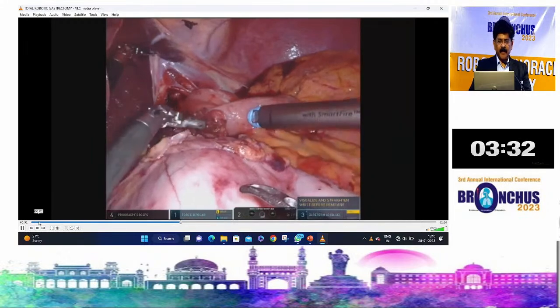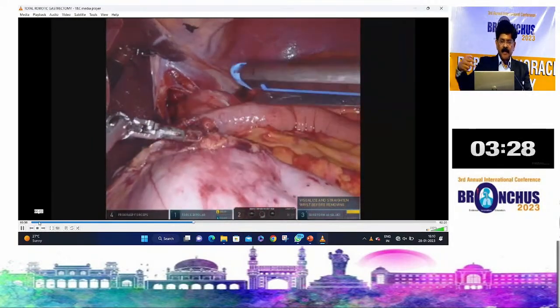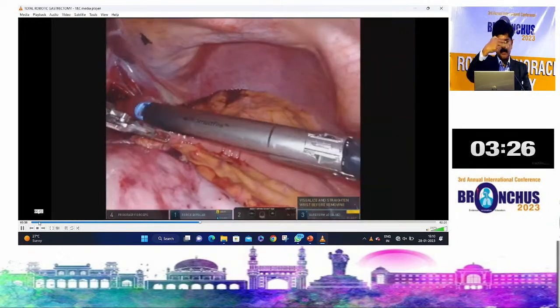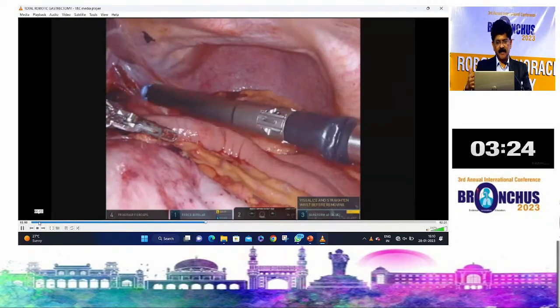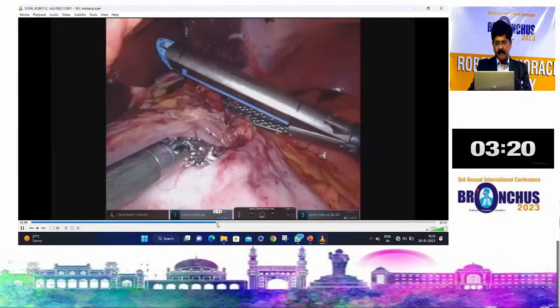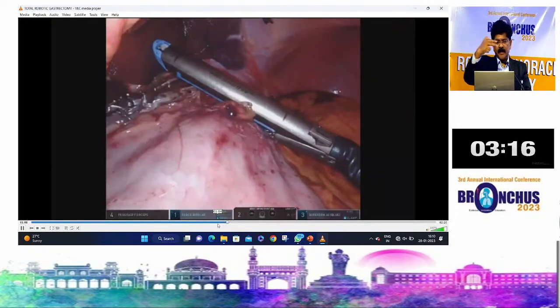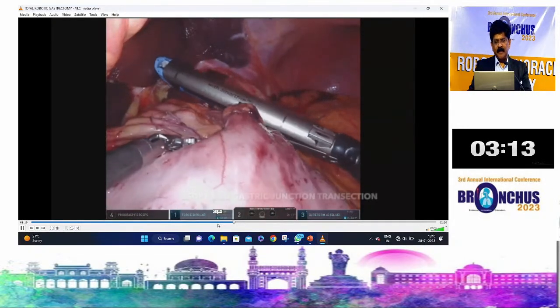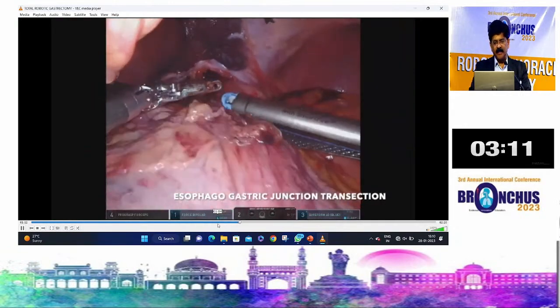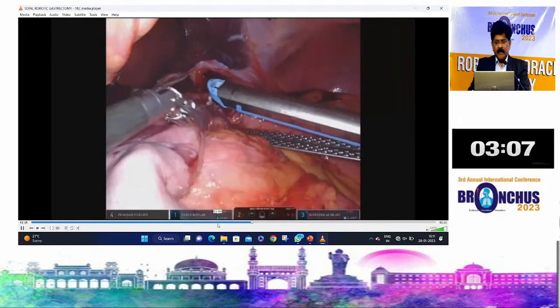This is a side-to-side esophagojejunostomy. And then the tumor specimen is already lowered down. And then we use another stapler across, below the anastomosis. That will resect the specimen. I'll just show it. So this is the way we do that. Do a side to side and then transect above the tumor, give a margin, and you can always send for frozen section, and pull the specimen down there.